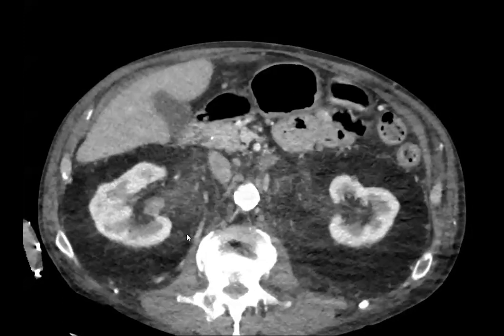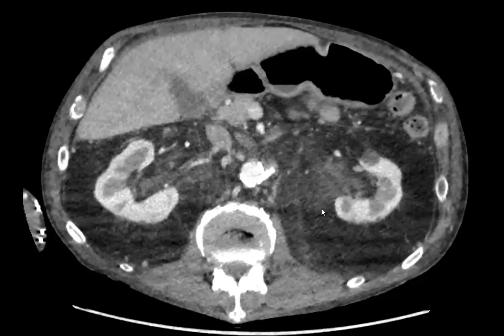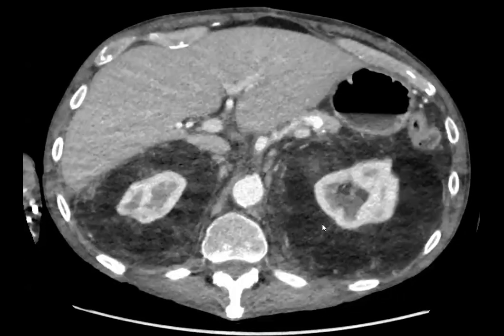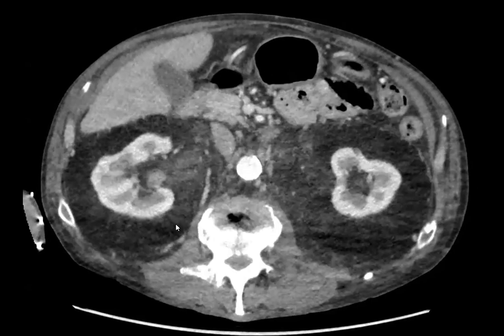Yeah, good thought. IgG4 disease is possible in the retroperitoneum like this, but it's a little unusual presentation. Right, and IgG4 is usually more fibrotic, so it might cause hydronephrosis, which it's not here. And other things we think about with pararenal soft tissue are Erdheim-Chester and extramedullary hematopoiesis.